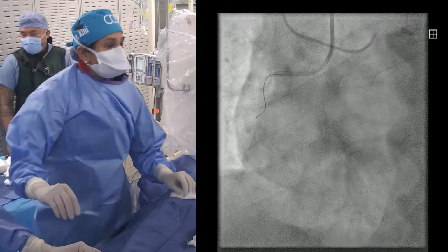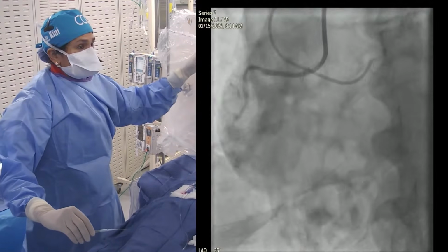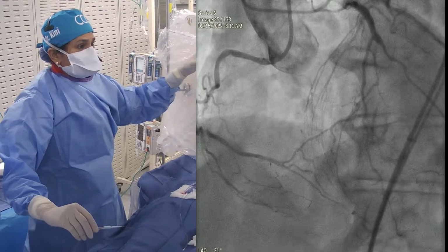Now what, you want to put it on the top for me? Wait. I just have to have a road map. Yeah. Okay.